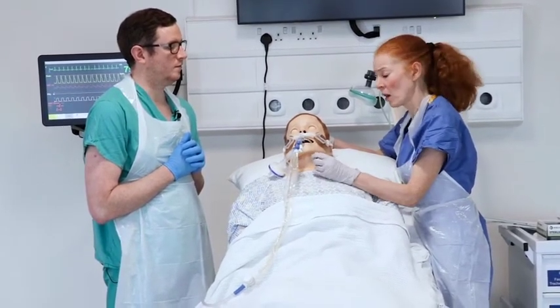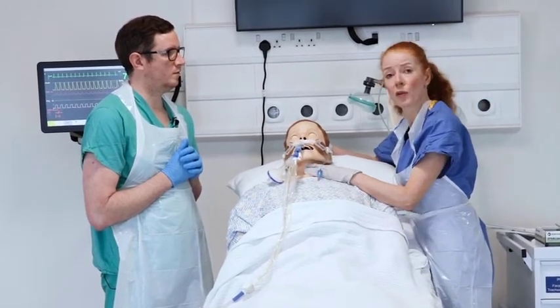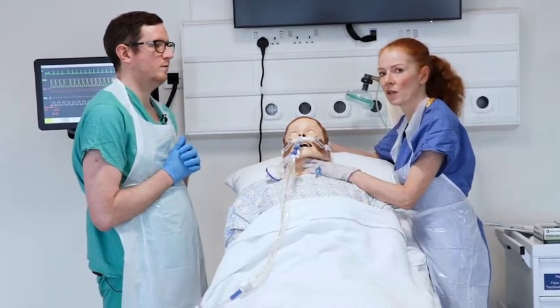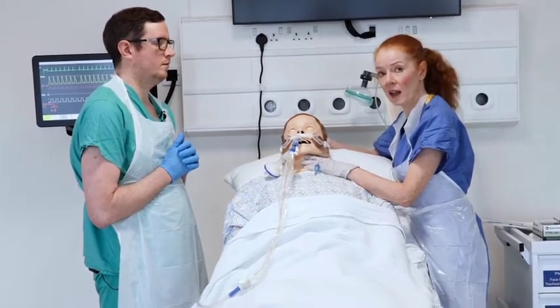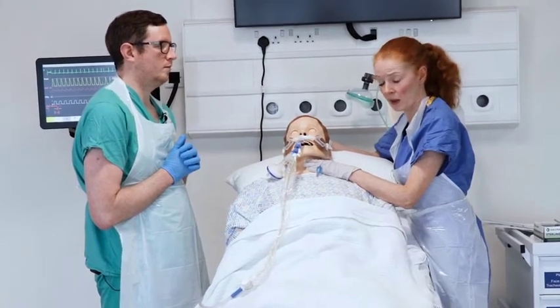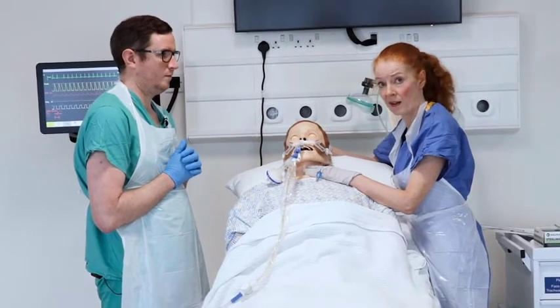It is very common for patients who are intubated and ventilated to get what's known as ventilator-induced or ventilator-associated pneumonia. If that occurs, you will likely need to suction the patient frequently. We would like to demonstrate how to do that safely and effectively.